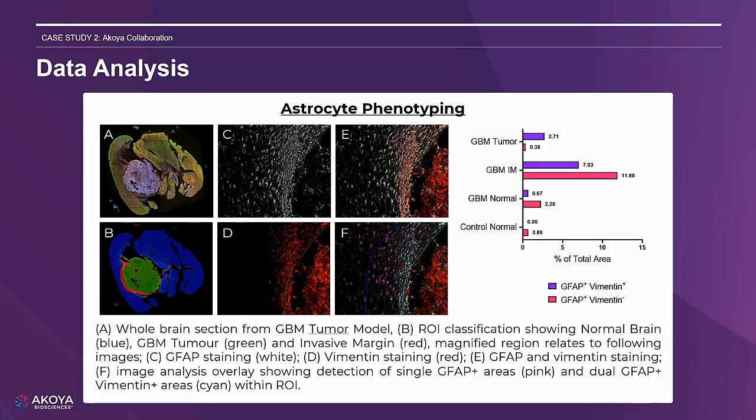Finally, using the area quantification data generated on Visiopharm, we can also visualize the data in graph form, which confirms that there was a much greater astrocyte density within the invasive margin ROI in comparison to the healthy or tumour tissue ROI.